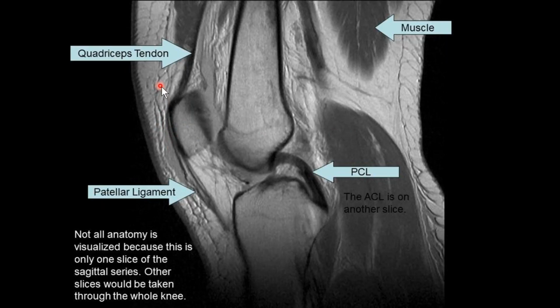So I can see superficial tissues. This is the quadriceps tendon. This is the infrapatellar tendon as it inserts into the tibia. This is the femur, more muscles, tendons of muscles, and then we will see the posterior cruciate ligament. And if we keep going in terms of slices, we will see the anterior cruciate ligament. And the x-ray we just showed you was an anterior cruciate ligament repair with the plugs. So sure, we can see a lot more with an MRI.